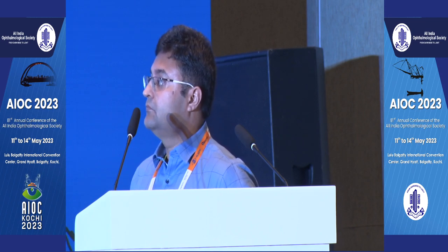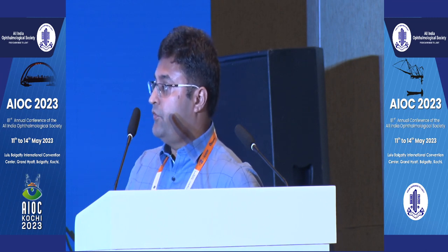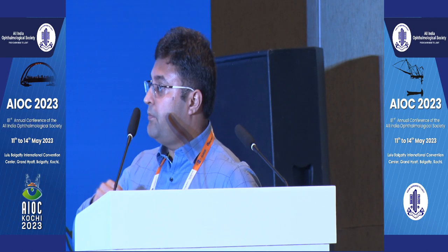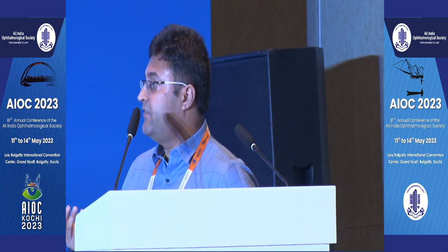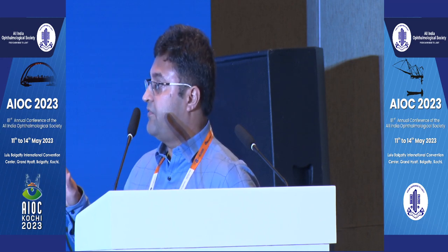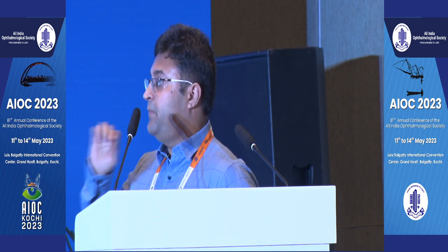So in case you had touched the artery or there had been a bleed? Yes, so I do have videos of that as well. If I do end up going through the artery, I get a gush of blood right through the vitreous cavity. For a lot of people it is very drastic because then you are left with a bleeding artery. But for me, it still works well because it actually pushes the emboli out into the vitreous cavity. And you just sit on that artery for some time, the adventitia is going to clot after some time. The lumen is not going to clot. It's not going to be a reblock.